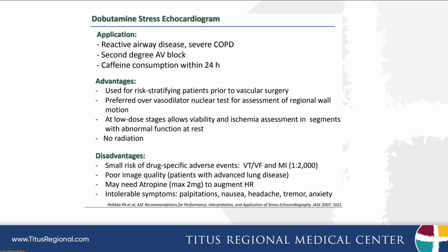Again, the other limitation to echocardiography in general for stress testing would be the ability to get good images and having a very experienced sonographer able to obtain those images in a very short period of time while the heart is maximally stressed.